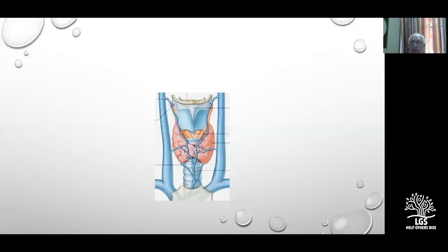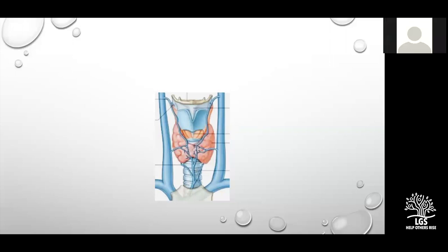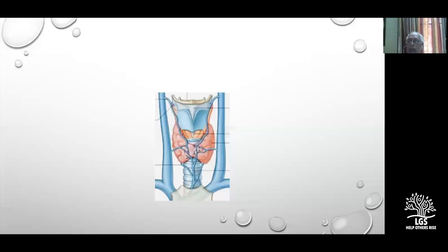Only ligate those veins which are in front of the trachea, draining ultimately into the brachiocephalic vein, which goes down to the mediastinum. Keep yourself close to the thyroid gland — don't go down. Ligate those veins in front of the trachea and you have now cleared a major portion of the lower half of the thyroid — not only the isthmus but also a bit of the lateral lobe becomes clear.